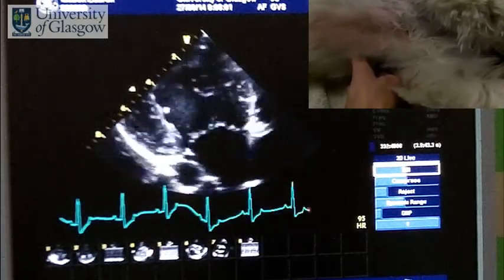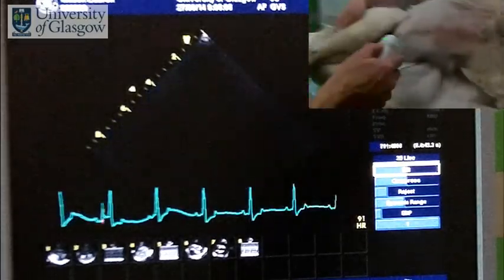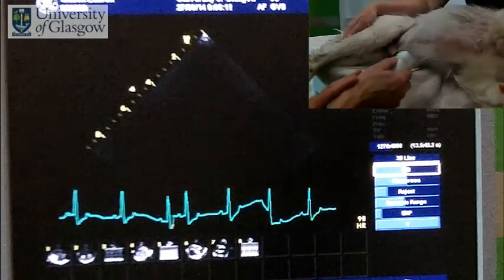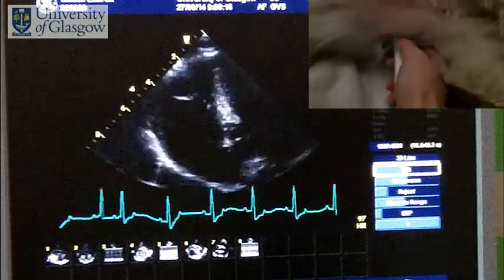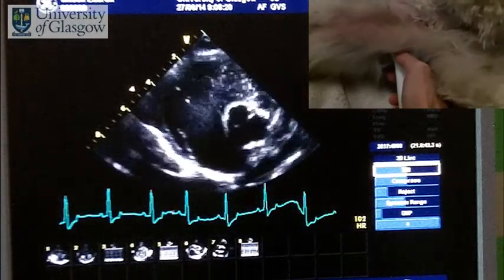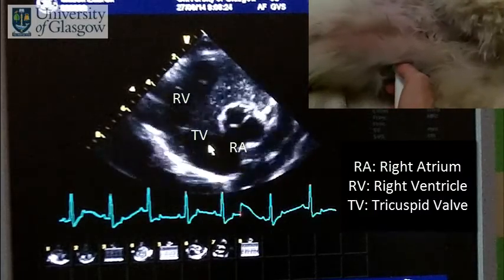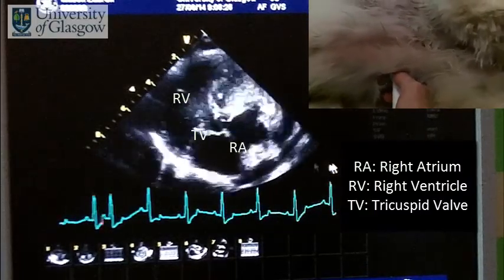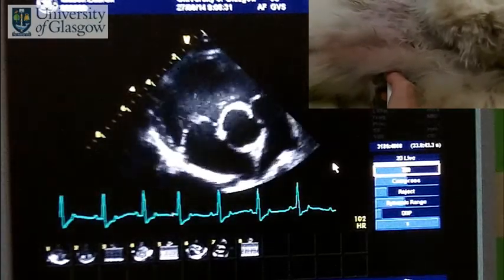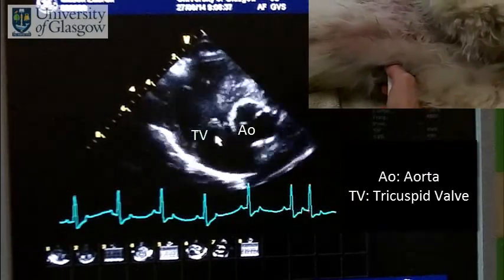If we want to look at the tricuspid valve on the right side, we need to move the probe forward. We come off and this time we're going to go approximately one intercostal space, keeping the same angle but moving approximately one intercostal space forward, and that will give us the right side of the heart. Now we're optimized to see the right ventricle and the right atrium with the tricuspid valve. We can look at the motion of the tricuspid valve to see if it's normal — you can see the aorta coming up in the center.